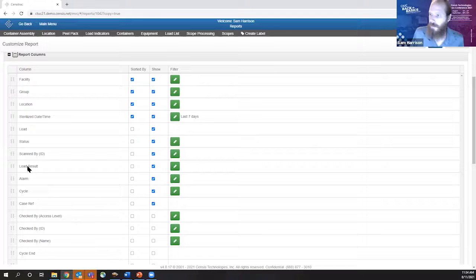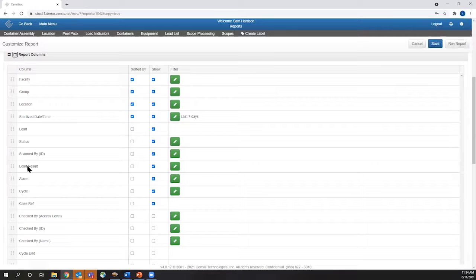Okay. The other thing is we haven't discussed case tracking, and that would be, so if you're using that case reference to refer it back to a case, assuming that's what you're using that for, we actually have the case tracking module, which wasn't reviewed at all.